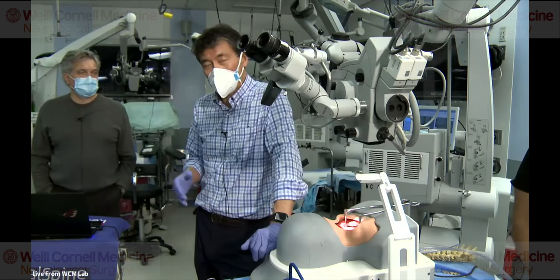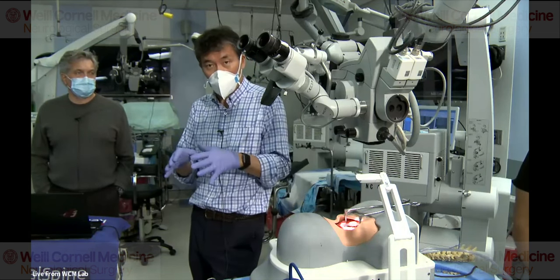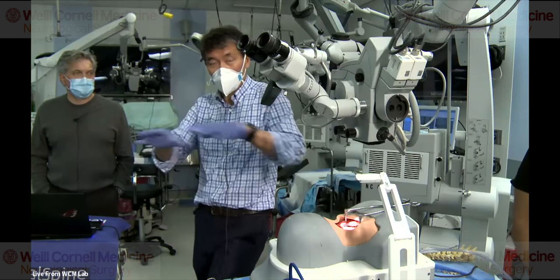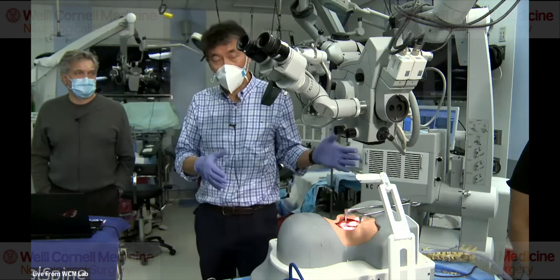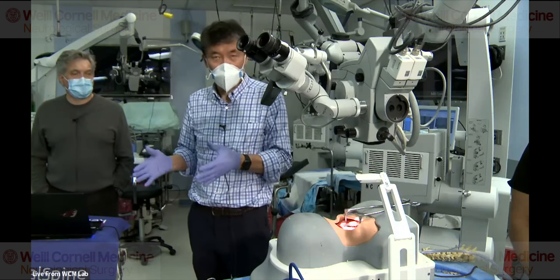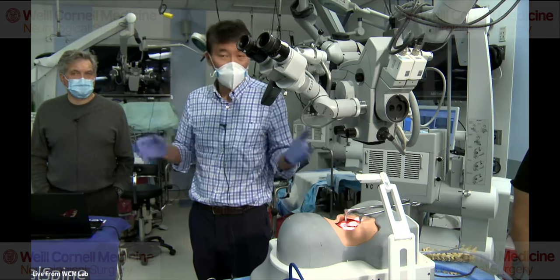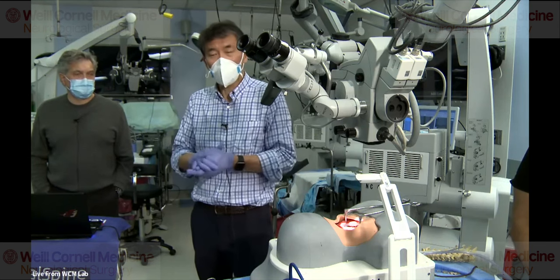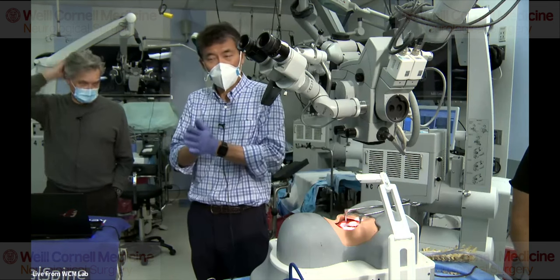But in the meantime, you don't want to put it on somebody you've done a laminectomy on, because it'll swell and cause cord compression. But with laminoplasty, you can put it on top of all of that, and it stops the bleeding. So you have very little bleeding intra-op, and you have very little bleeding post-operatively. And so that's how you want to do it. Minimize the bleeding, minimize muscle trauma, come right down the middle in the avascular, amuscular plane.